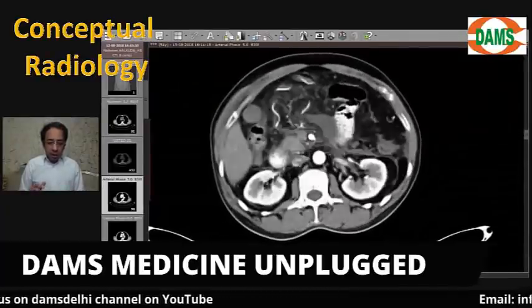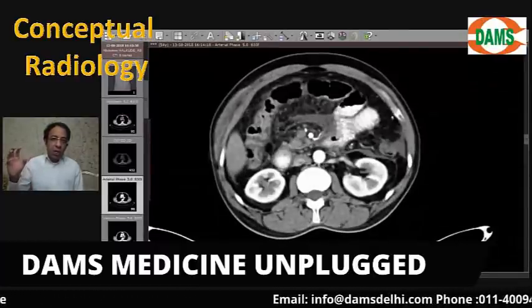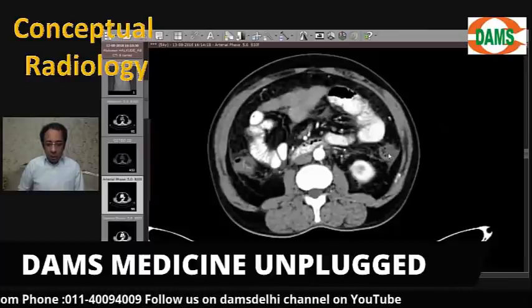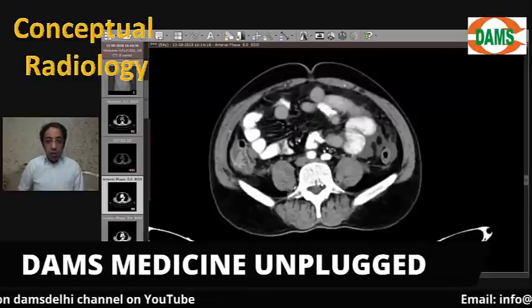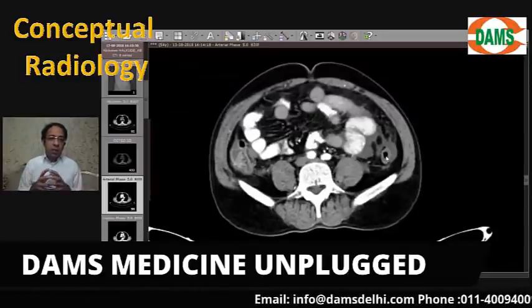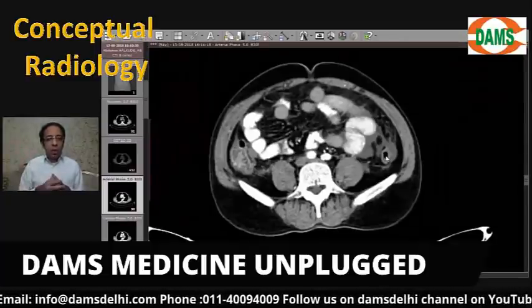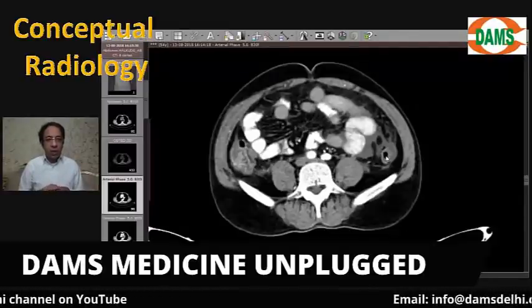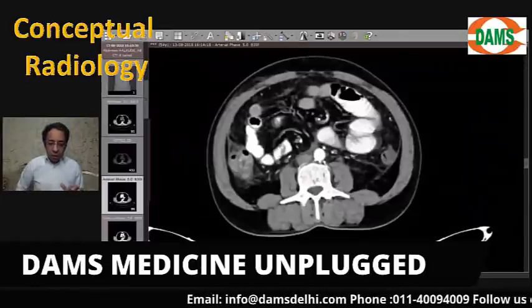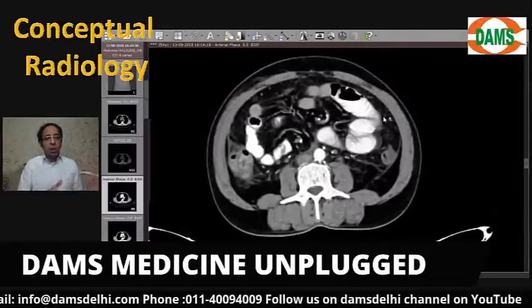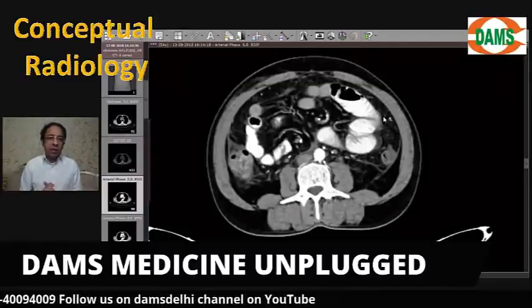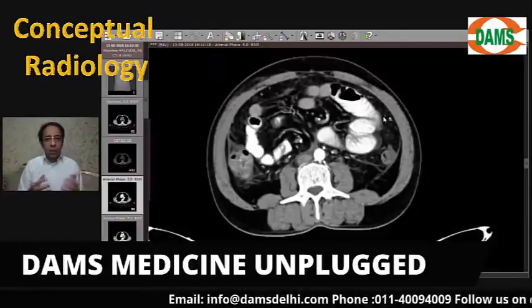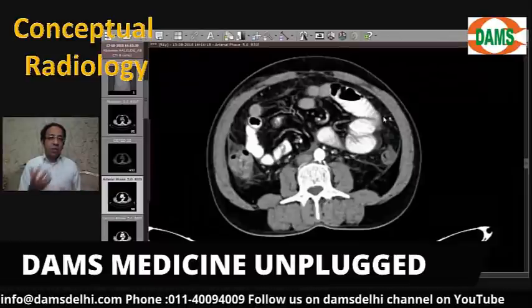Let me trace the anatomy and explain why we saw air in the transverse colon on the scout film. Look at the descending colon where my arrow is - this descending colon shows spasm. In patients with acute pancreatitis, the descending colon develops spasm, so after the transverse colon at the level of the splenic flexure you get a cutoff. On a plain film this is called the colon cutoff sign. The focal dilatation of small bowel loops seen here is called the sentinel loop sign - both of which we saw on the plain X-ray.